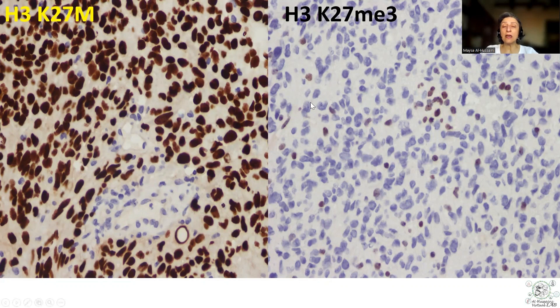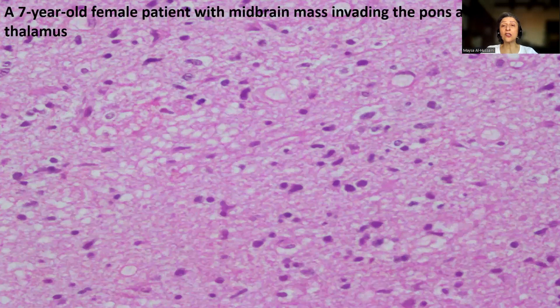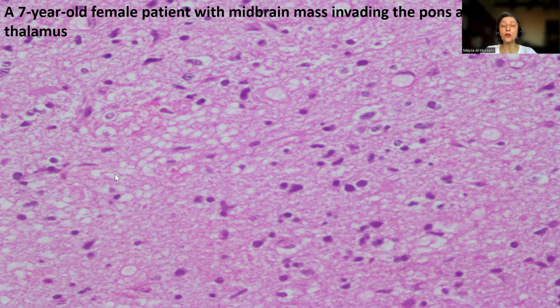Let's try another case — actually a more challenging one. This is a 7-year-old female patient who presented with a midline mass invading the pons and the thalamus. If we look at the tumor, it is really low-grade; there may be some atypical tumor cells, but we might not be quite sure. Would we assign a diagnosis of diffuse midline glioma with the associated dismal outcome?